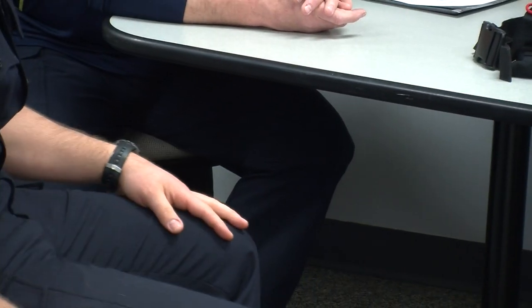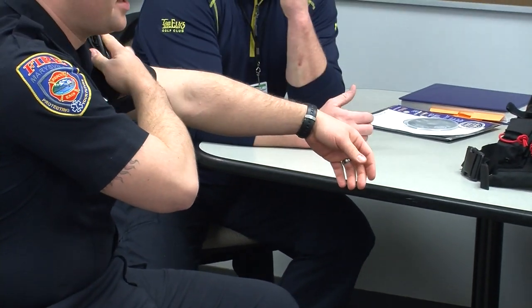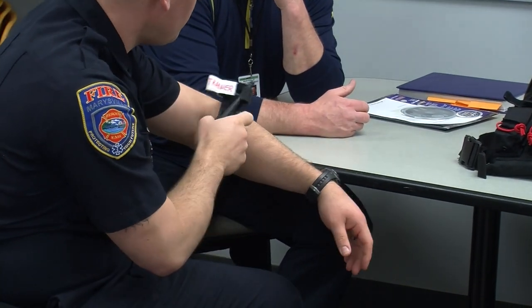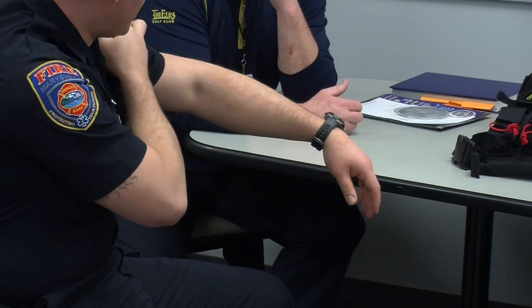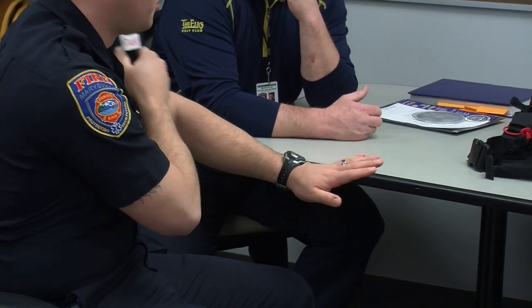If I take around the one arm, I can pull this out of my pocket, and it just slides right into it. And then I can cinch it down from there. But to put it on your arm, leg, whatever extremity you're going to put it on, put it up as high as you can, no matter where the wound's at. Put it as high as you can, grab the end here, and we tighten it down.